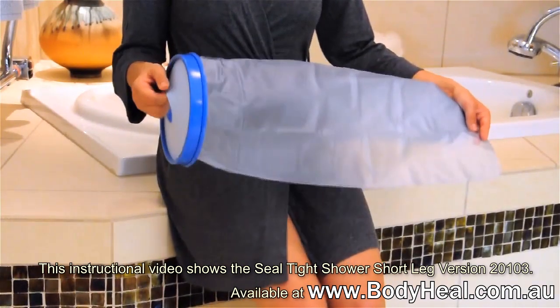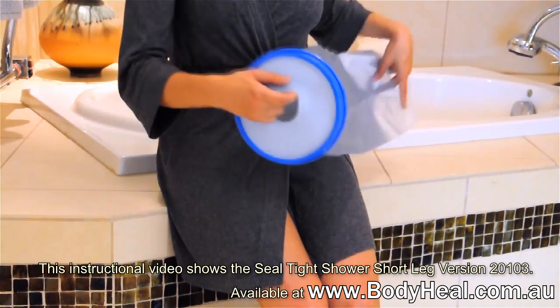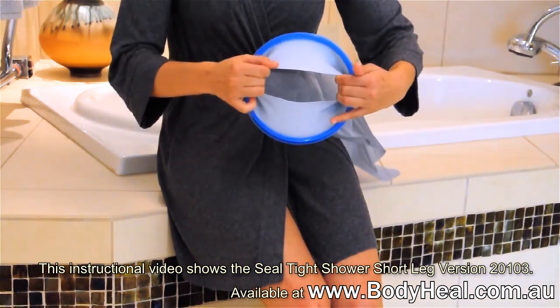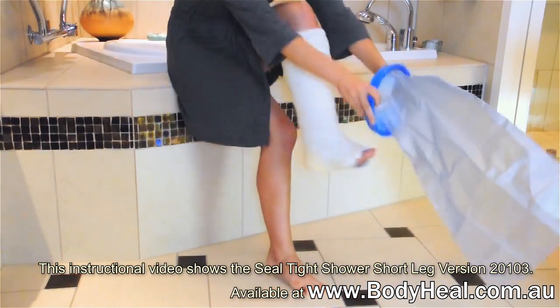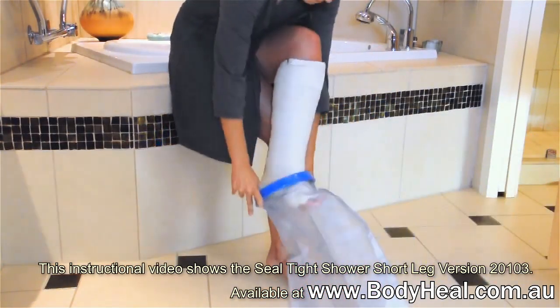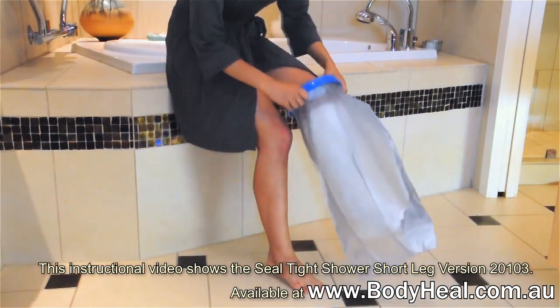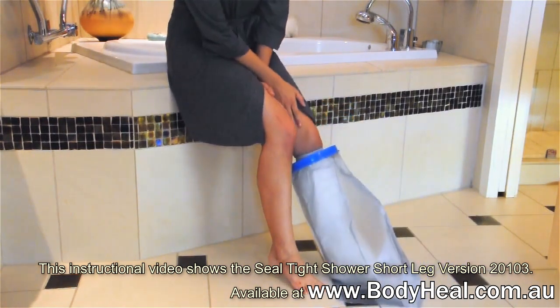Here's how easy it is. After removing your cast protector from the box, unfold completely. Pull the ring containing the diaphragm taut. Insert your foot into the diaphragm and pull the seal and bag upward until your cast or bandage is completely covered. You will know it's at the right position on your leg when the diaphragm sits comfortably above the top cast edge.